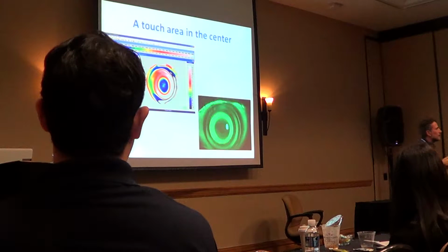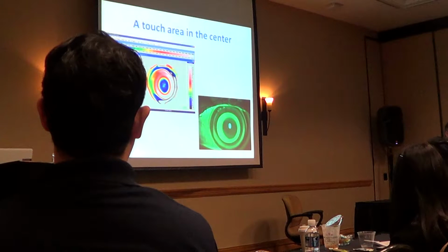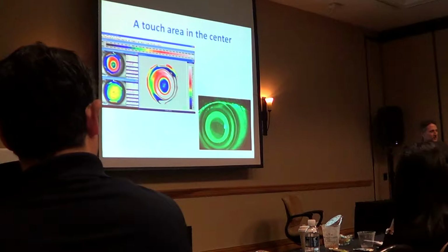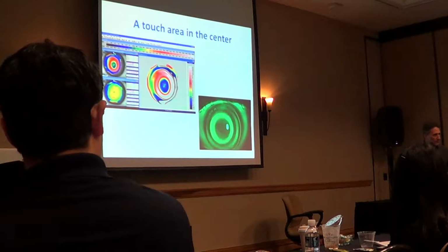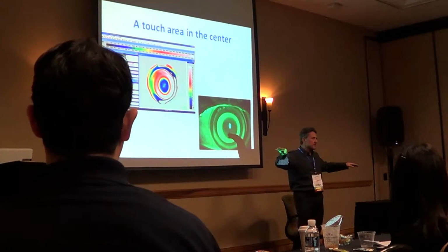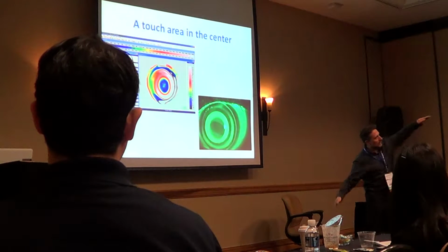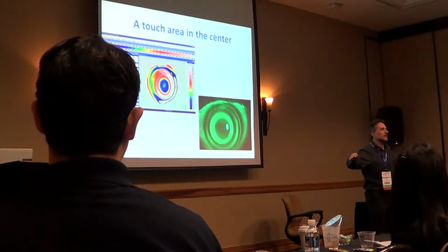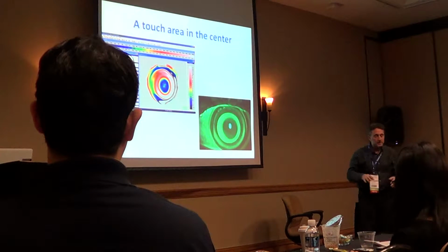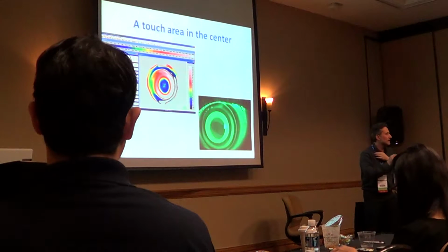Now we know what we need to do here. We need to increase the sagittal height of the lens in the central zone because we don't want touch. So the reverse curve needs to be steepened a little bit to secure the central zone. And the peripheral landing zone or peripheral alignment curve needs to be steepened a little bit to obtain the perfect alignment all around. And the diameter needs to be a little bit larger to obtain the perfect alignment with the corresponding cornea. So that's the thing we need to do. So looking at that, following the steps, we know what we need to do next.